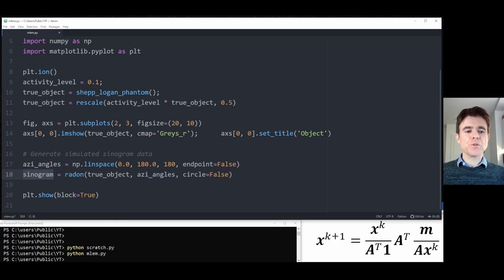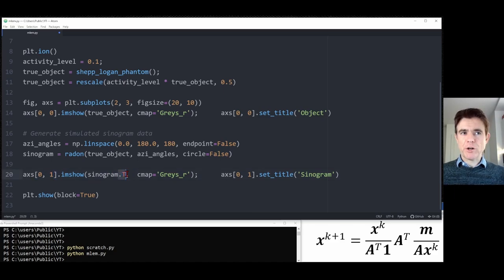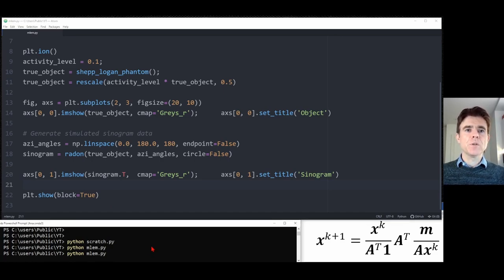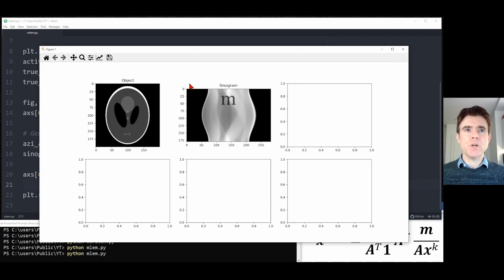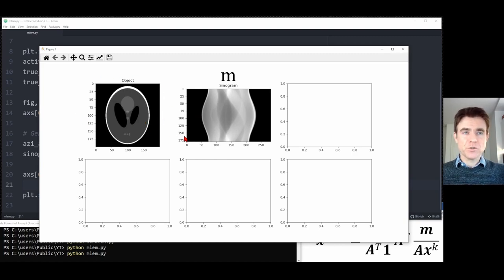We'll call that the azimuthal angles, used for the radon transform to forward project along different angles, and that will be our sinogram. We'll also take a quick look at the sinogram — that's the first row and second column. We show the transpose of the sinogram so the radial coordinate is along the horizontal axis and the viewing angle is vertical, using grayscale, labeled as 'sinogram'. The sinogram now has 180 viewing angles and an increased number of radial bins, covering the entire square field of view.